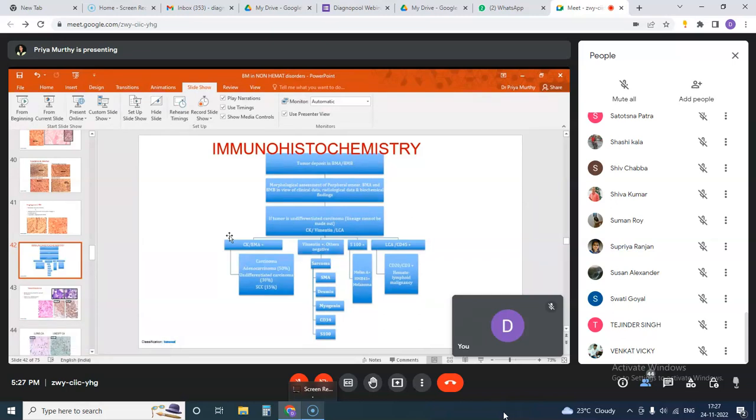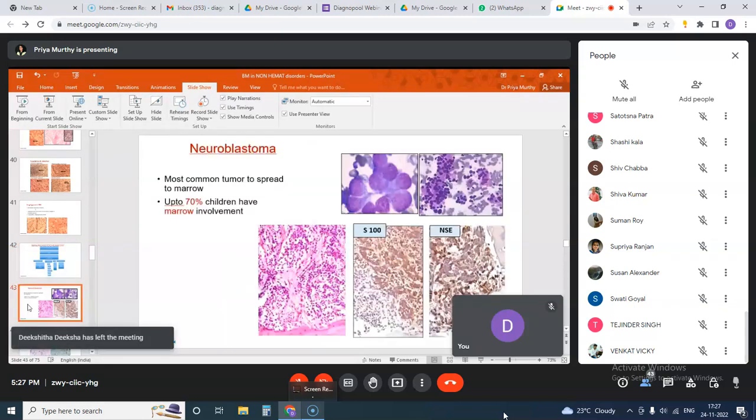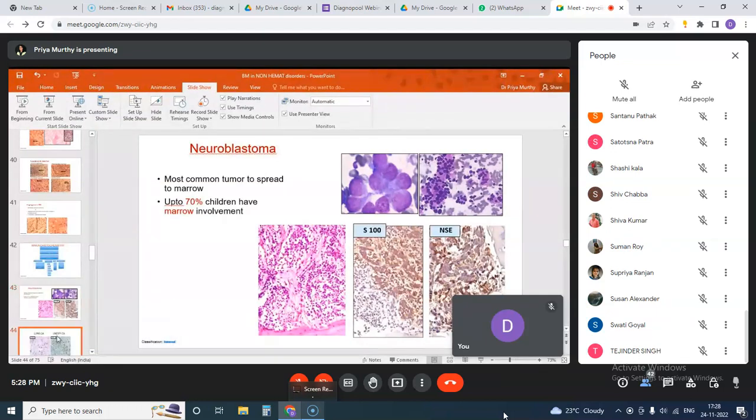First, we will do a CD45 and a CK to ascertain that it is not a hematological malignancy. And after doing CK, we do CK7, CK20, and the whole range of antibodies can then be performed to detect the unknown primary. So this is an example of a neuroblastoma which we saw, clusters of small metastatic round cells, and you're seeing this pseudo rosette formation, and the biopsy showed similar small round cells. They turned out to be S100 and NSE positive.